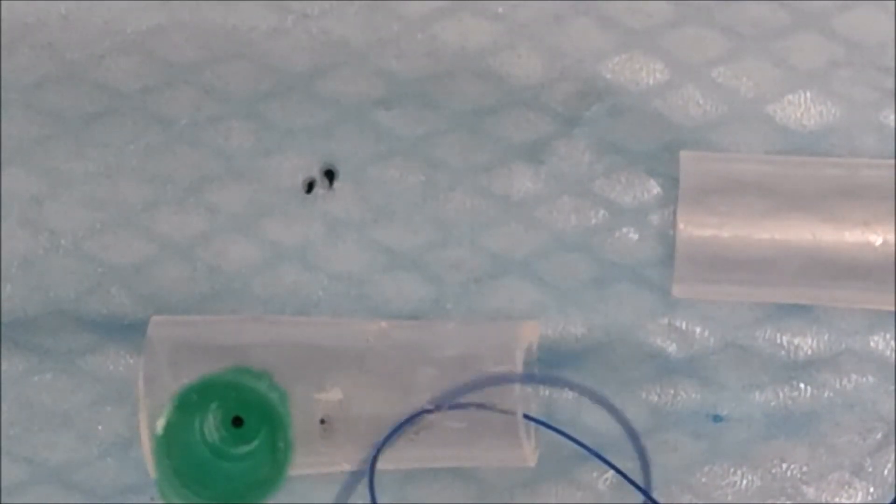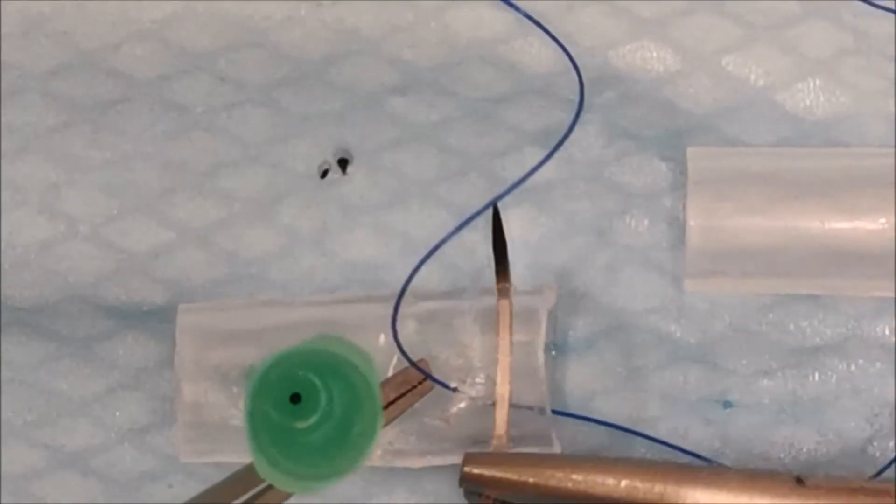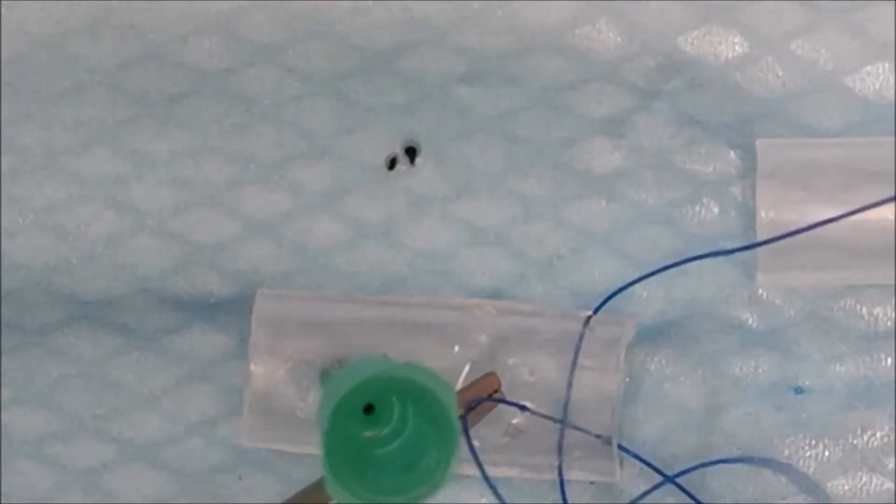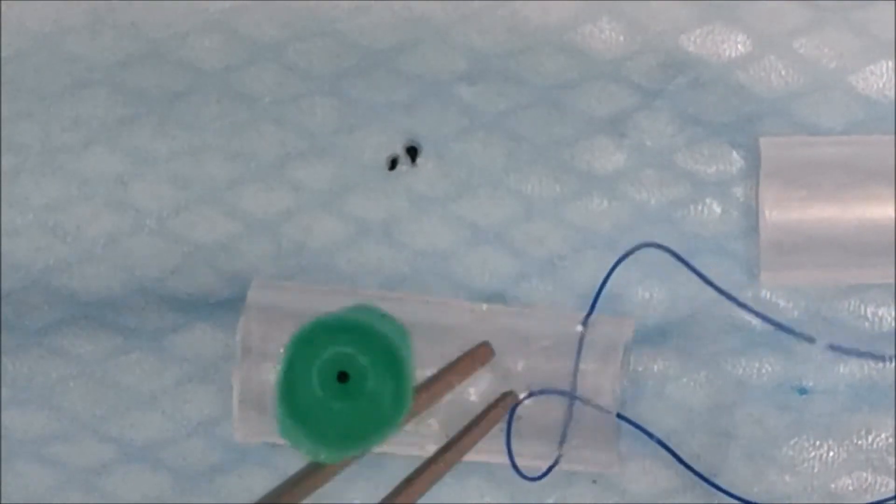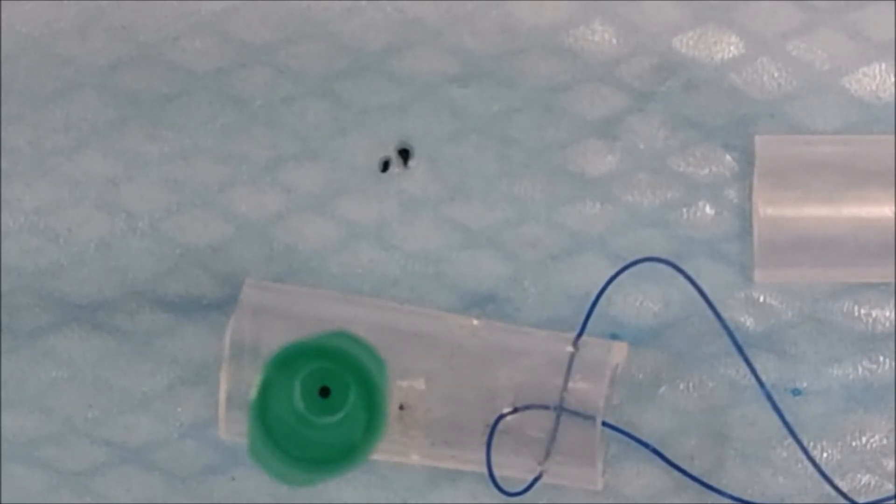Another common error is actually doing your repair too close to the end of the tendon like this. It's a good grasping loop, good suture, but you're not taking a centimeter of the tendon and you don't have enough good tendon.